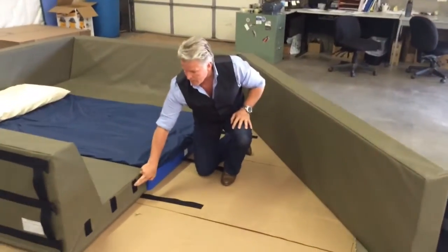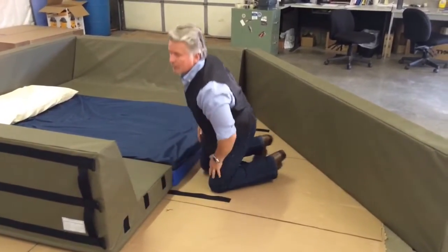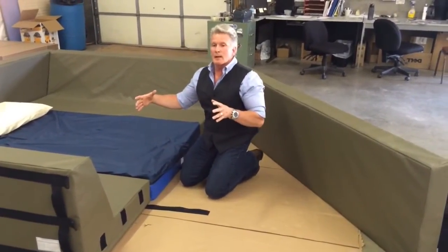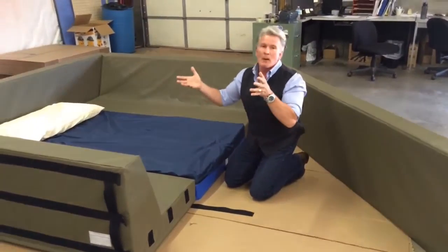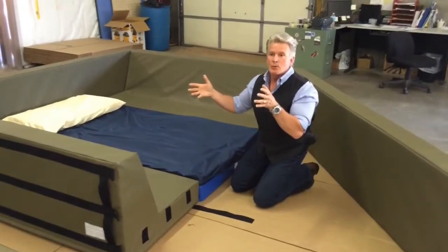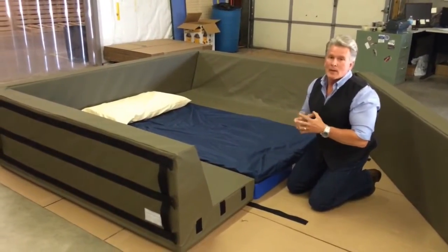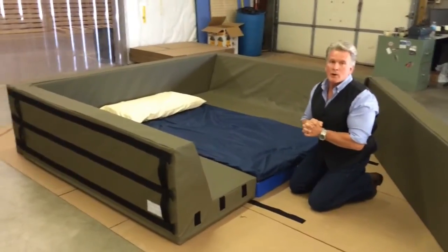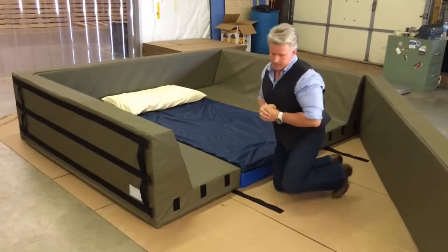You'll see some Velcro stripping there. That's there if we go to the system that has the elevators to raise this whole system up about 9 inches to accommodate a bed underneath this. That's how that would happen. We had it, we just want to make it stronger and more secure before we bring anything like that into your facility.